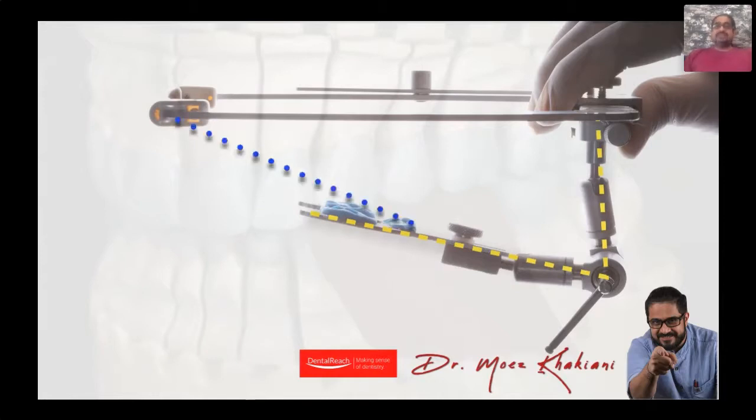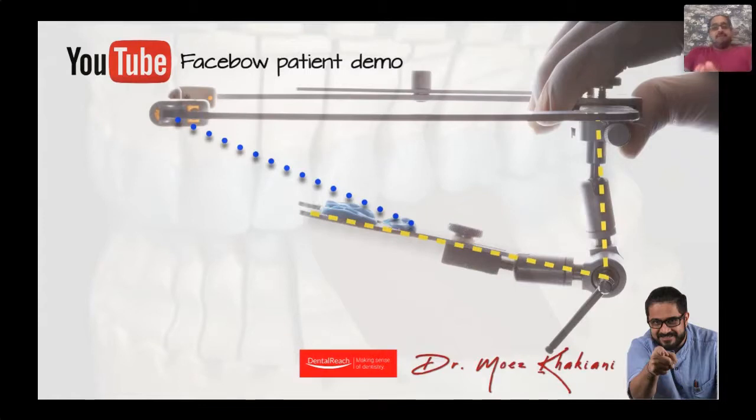What it also gives me is the distance from the condylar head right up to the maxillary incisal edge. Now, why is this important? Because this determines what is called the arc of mandibular opening. This becomes important in any case where you change the vertical dimension, which is almost every case of full mouth reconstruction, right? Which means when you are working on a full mouth rehabilitation case, a Facebow record and a semi-adjustable articulator are compulsory.